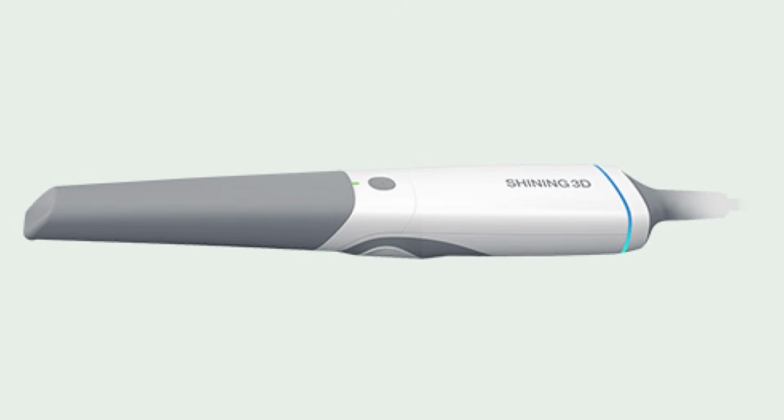Try to use putty and light body, which is very beneficial, because the quality of materials you use in a clinic will definitely show up in the crown or whatever work you are doing. Sometimes people are also offering 3D scanners in your clinic. Call them. They are providing it for free. You can just tell the patient to wait for 1 day, and the scanner person, the lab technician, will come and scan the tooth. So many advanced techniques are available. Why just stick with alginate and take the impression?